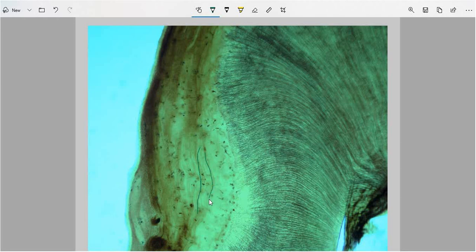These incremental lines are unevenly placed, meaning they are not constant. These unevenly placed incremental lines are known as the incremental lines of Salter.